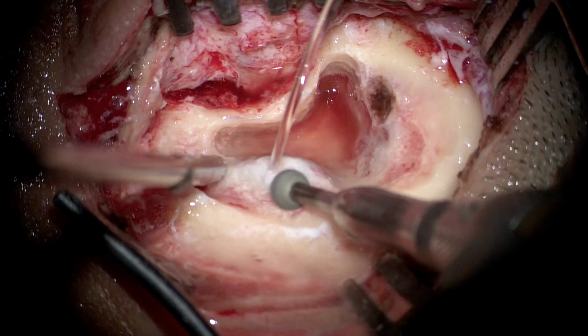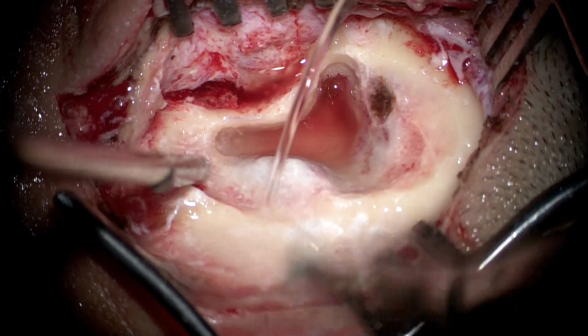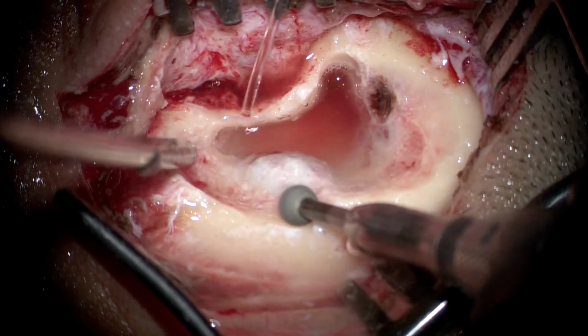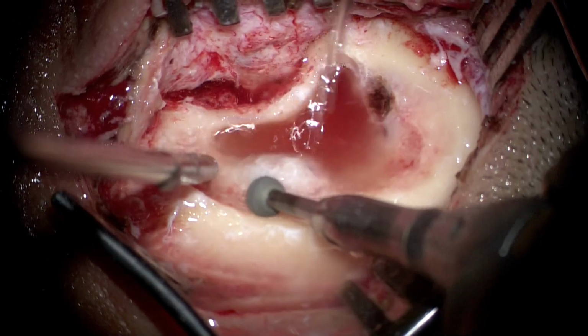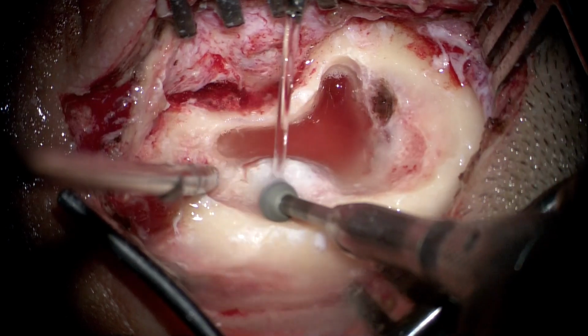But since we are to drill the entire labyrinthine block completely, this exposure has to be considered inadequate and has to be substantially increased for us to achieve a good medial exposure.